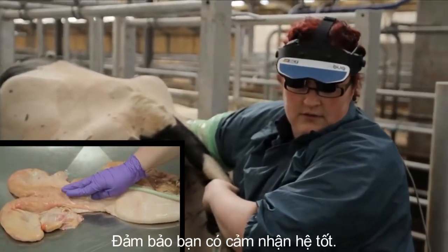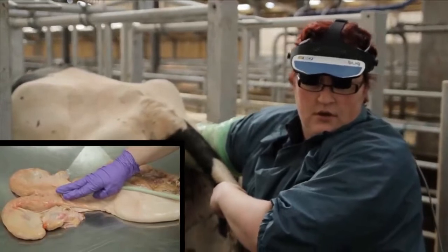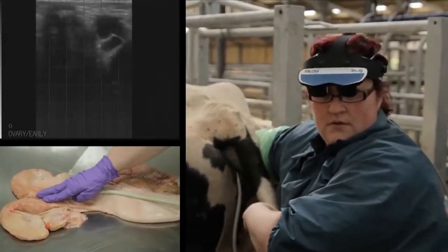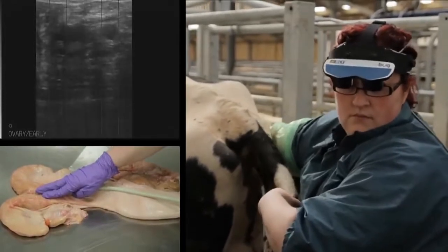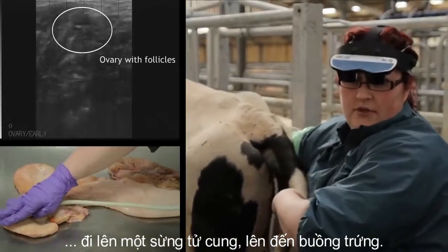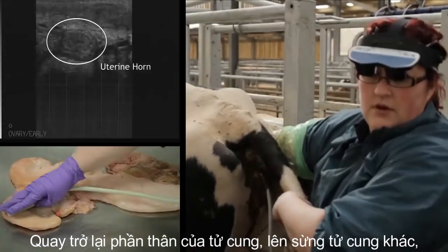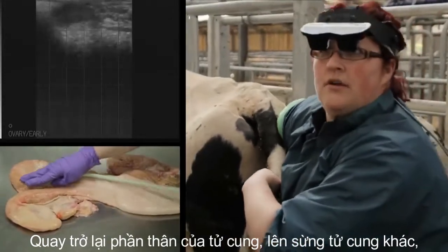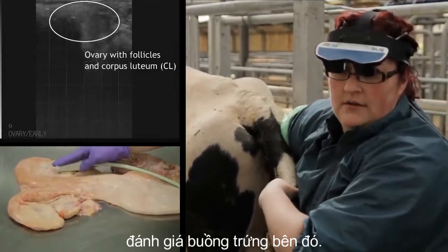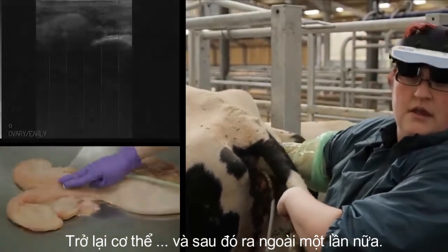Ensure you have good contact and come to the body of the uterus. Travel up one uterine horn up to the ovary, then come back down to the body of the uterus, and up the other uterine horn to evaluate the ovary on that side. Then back to the body, and out once more.